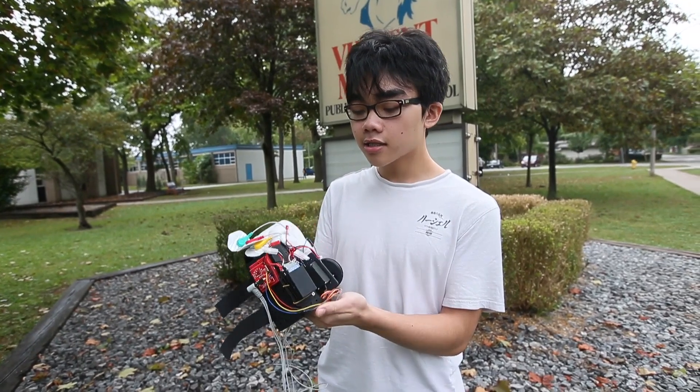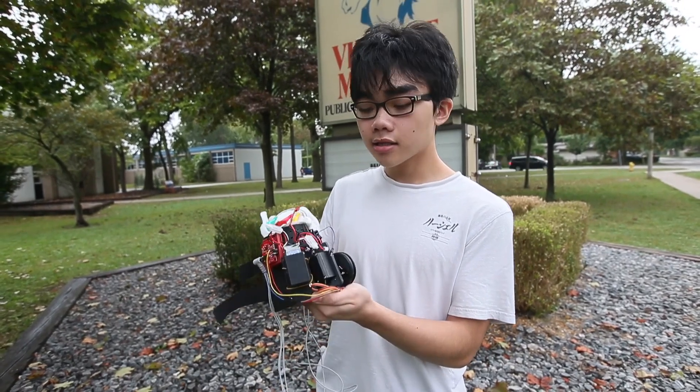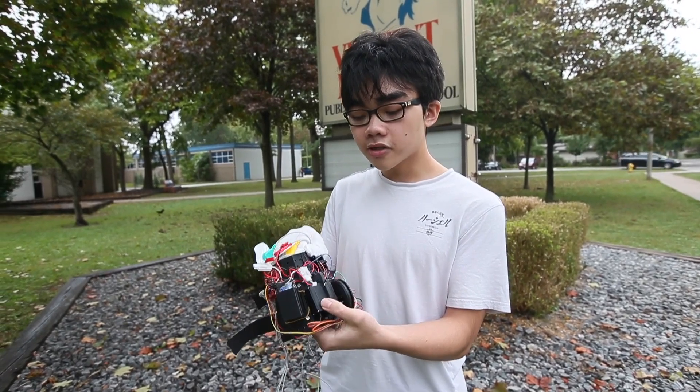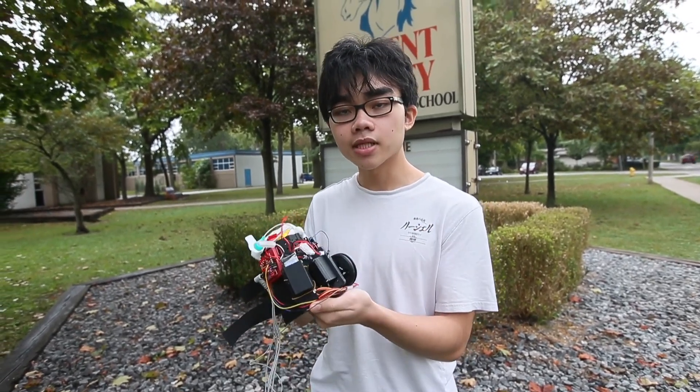I made all the hardware for it — I wired everything and sourced all the components. There are just a few motors, a microcontroller, as well as a sensor to detect muscle movements.